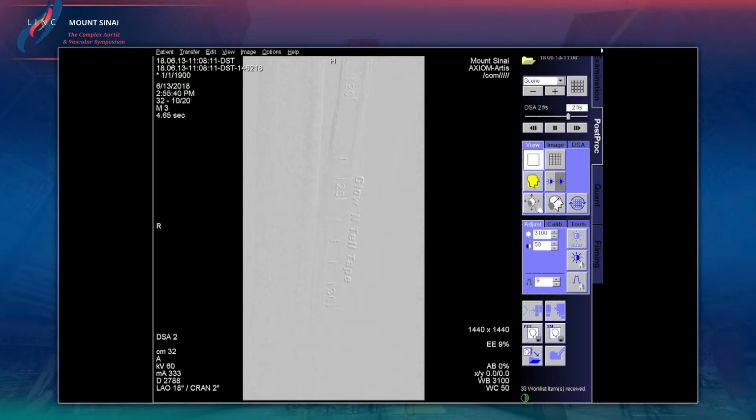I also agree with you in terms of limited number of cuts. I think the TurboHawk series does a very good job of debulking. I would be cautious about being too aggressive this far down, and also watching your nose cone as well. You want to make sure the nose cone isn't going past the wire at the ankle. So I'm going to just do a cut from 20 to 30 here, very slowly, and then we'll take a look. So, ready, guys?